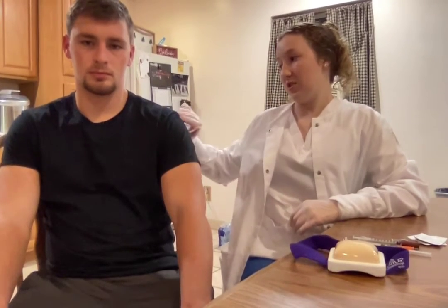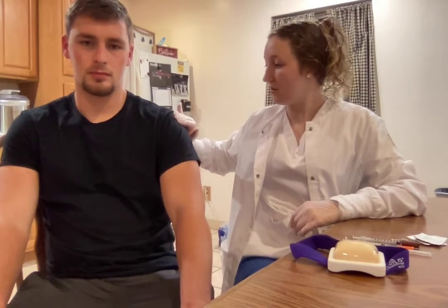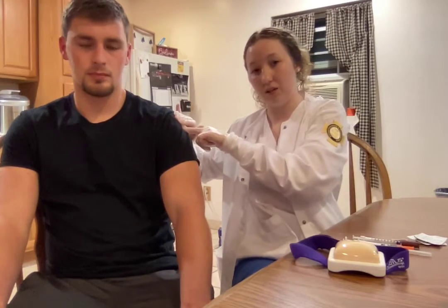I'm going to start with intramuscular injections. You can give intramuscular injections in the deltoid muscle, ventrogluteal, or vastus lateralis. To find the deltoid, you're just going to find the acromion process, and then you're going to go about 3 fingers down, and you're going to give it right there in the muscle.